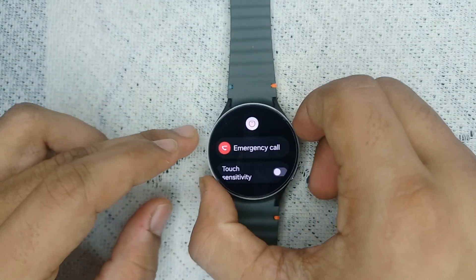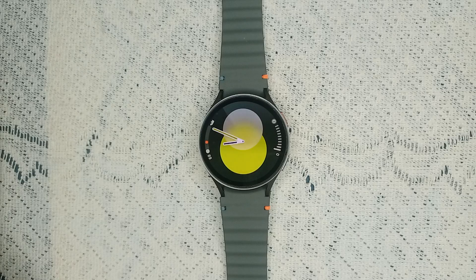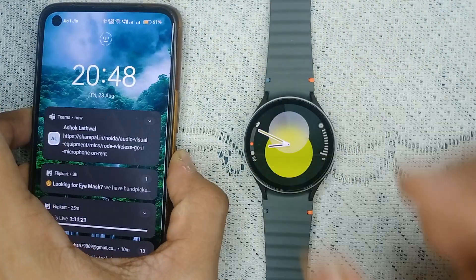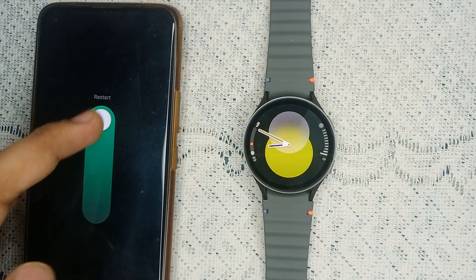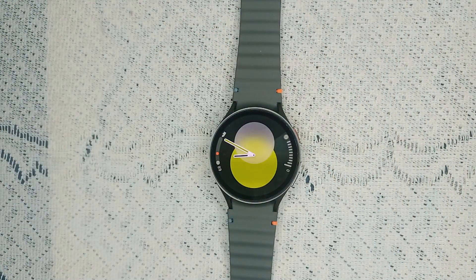It will take two to three minutes to restart your watch. You can also restart your smartphone by long-pressing the home key until you see a restart option, then swipe up and restart your phone.